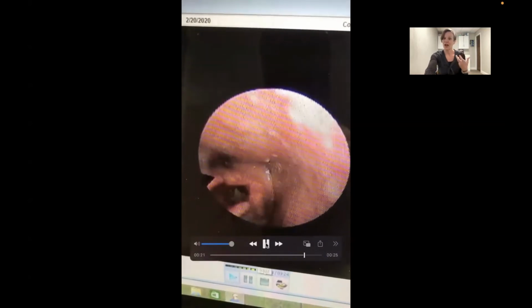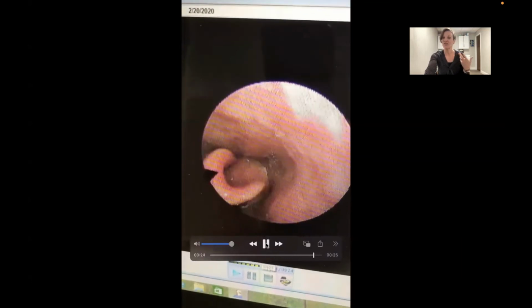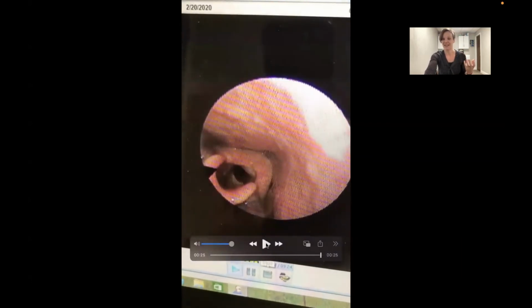Residue following treatment of head and neck cancer is one of our greatest barriers in allowing our patients' swallow function to return to some normalcy. They have a significant amount of difficulty, oftentimes, pushing the bolus through the pharynx. So when I complete my fibroendoscopic swallowing studies, I'm looking for residue as one of my key factors. Now, we do love Dr. Curtis's VASIS scale. We utilize that here with our scoring.